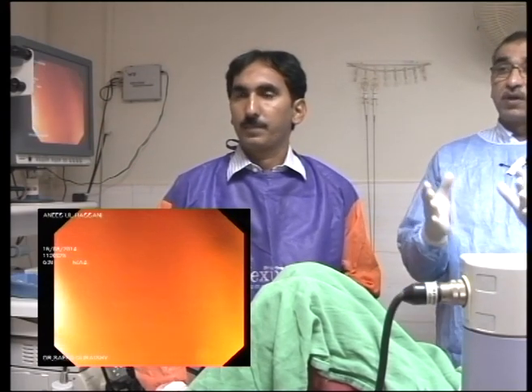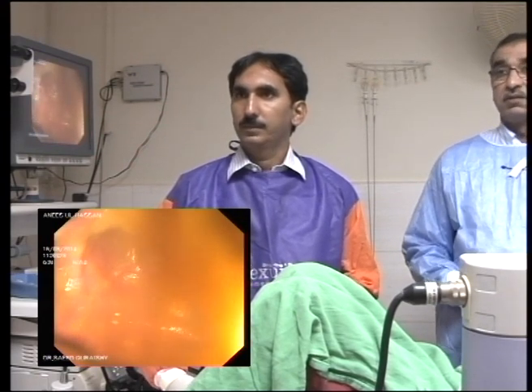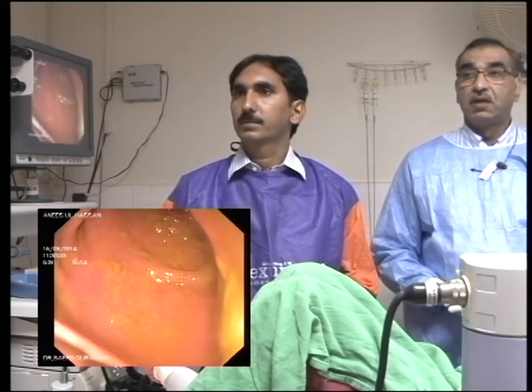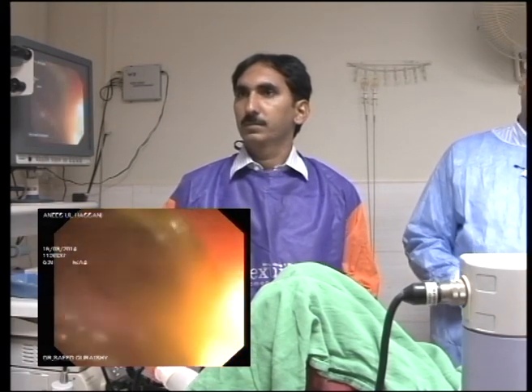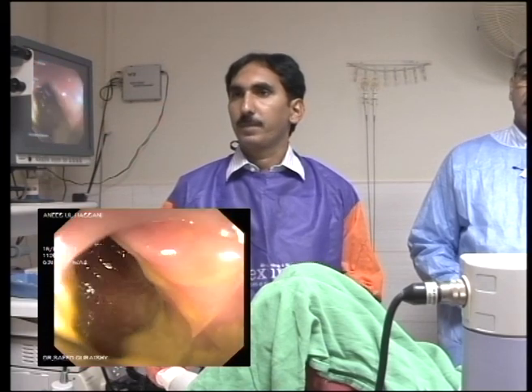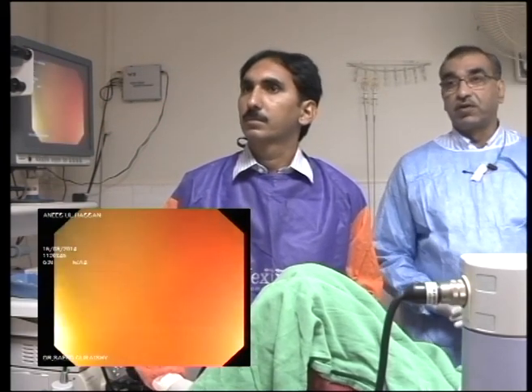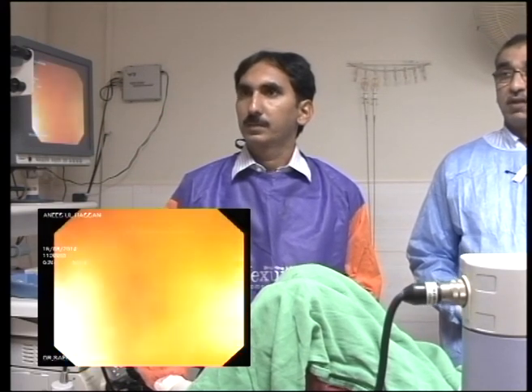Leave it. Let it open up. Don't inflate unnecessary air. It will open up by itself. Okay. Yes, that's right. Good. That's good. Point away from it that way. Yeah. That's good. Right? Obviously the bowel prep is not very good, so it is going to limit the quality of your examination. Okay?